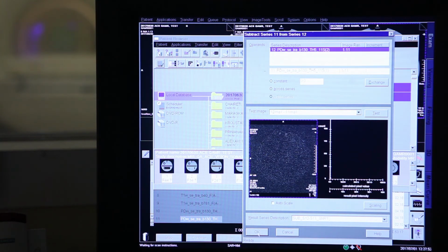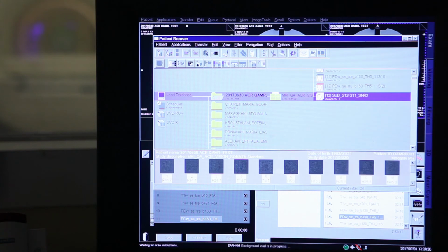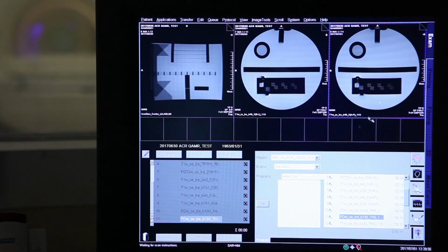Then you save this. And we know now that SNR1 is without the scale, then SNR2 is with the scale, to see what we get in other statistics. It's important. Let's do the refresh. You remember this. Here it is. Now, prior to going to the post-processing of these, it's easy to do it with the software itself. I'll explain. Then we go to see the slice thickness.